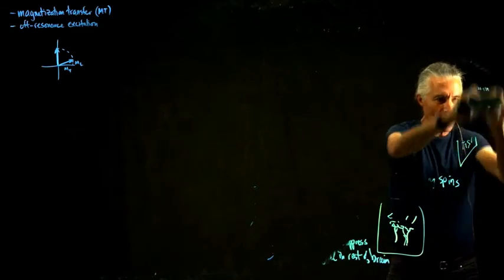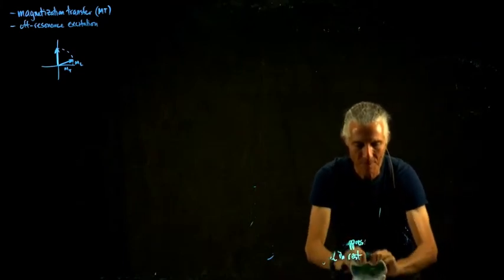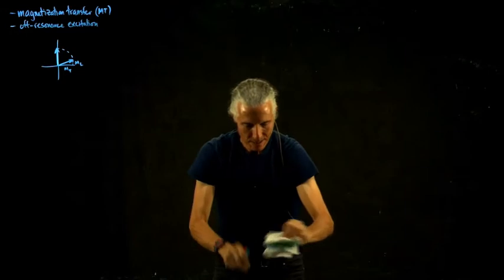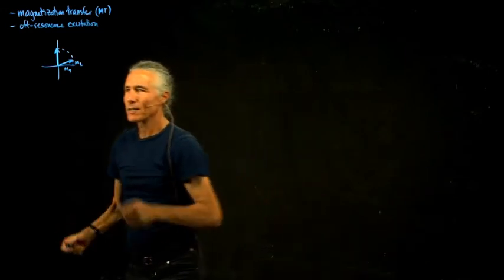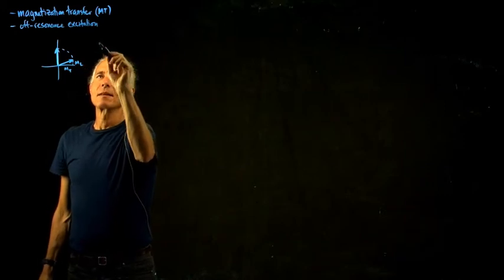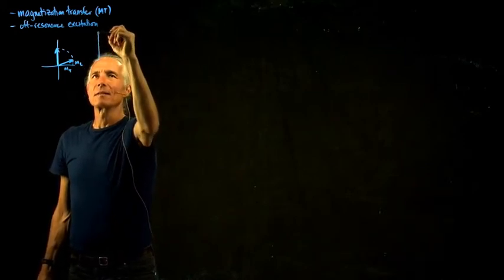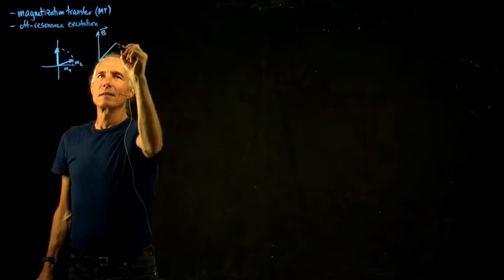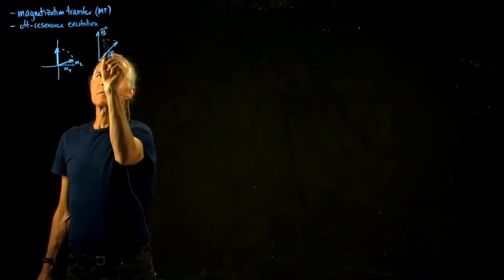So if we conceptually go over the stages of simplification. When we first started off, when we were talking about the Bloch equation, we had the B field here, and then we had our local magnetization vector, and that was precessing around.